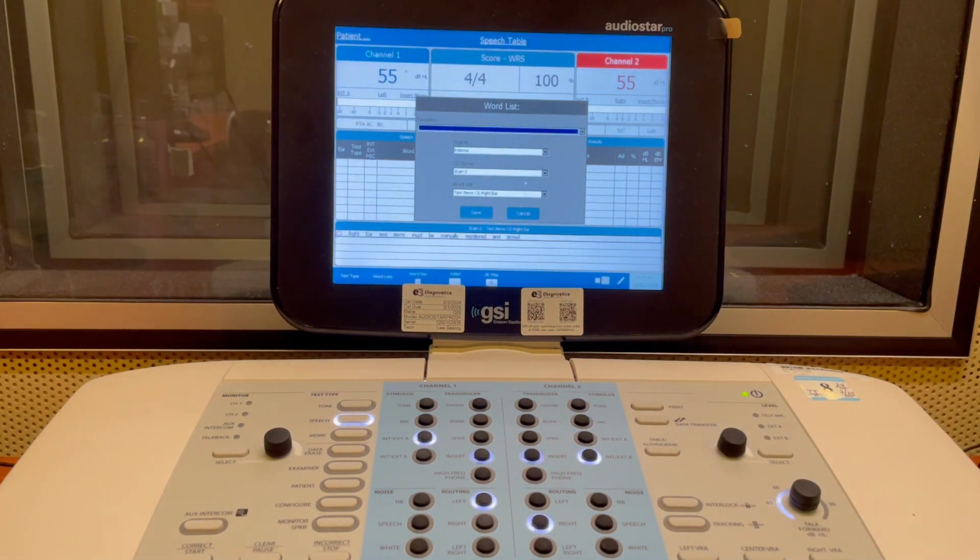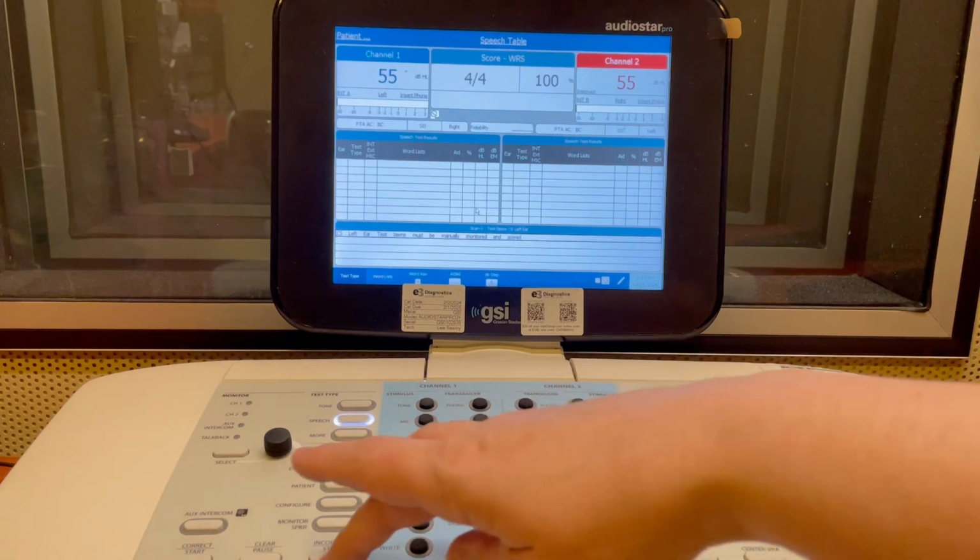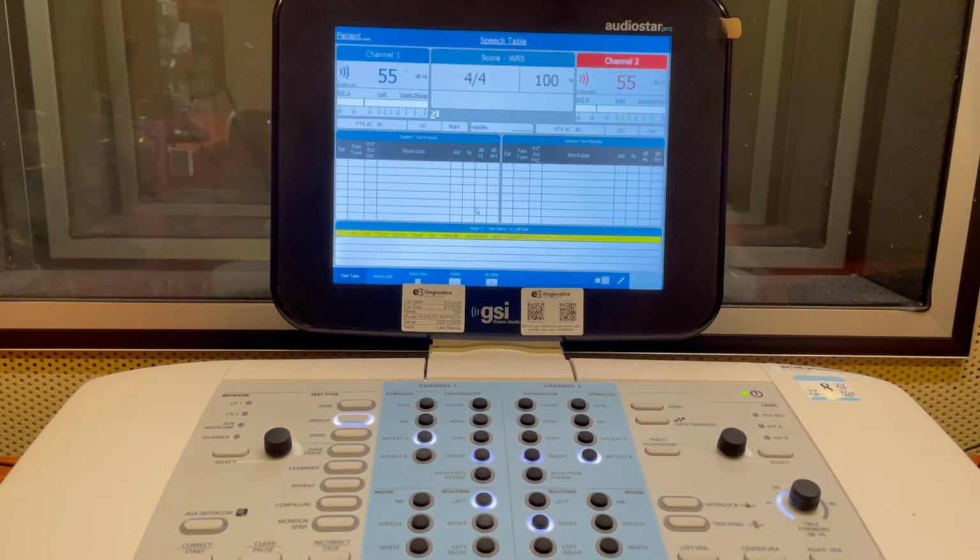So after you've done the right ear, you will click to do the practice or the test directions so they know to ignore the right ear and only say the sentence in the left ear, practice items, and then the test items for the competing sentences left ear. And so you would just click on that one and it's the same. You would just interrupt right and left, and it's set up so that it will play the same. It's just the instructions are different and the sentences are obviously different.